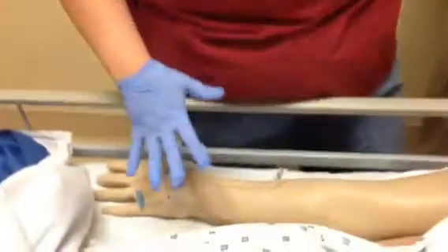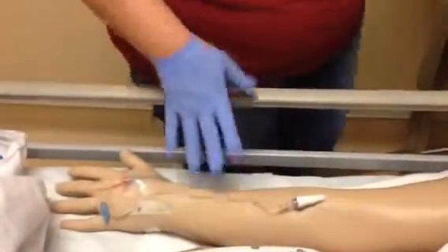Okay. Now, when you're giving an IV push medication, just like with Mr. Dunn's IV, he has a saline lock. He doesn't have fluids going to it. It's just saline locked. Now, we always have to verify the patency of our IV to make sure that it's not going to infiltrate, because we would want to make sure it's patent before we put a medication that might be irritating to the tissue. So we need to make sure it's patent.